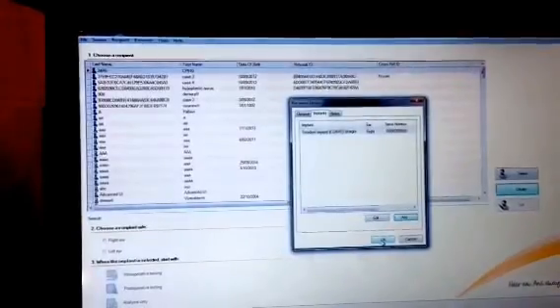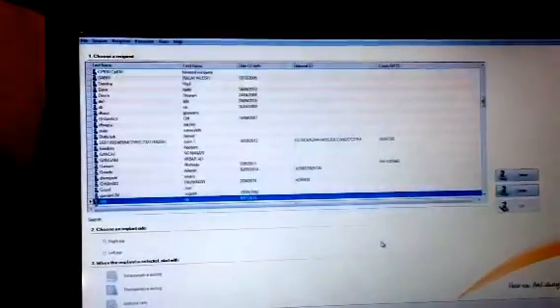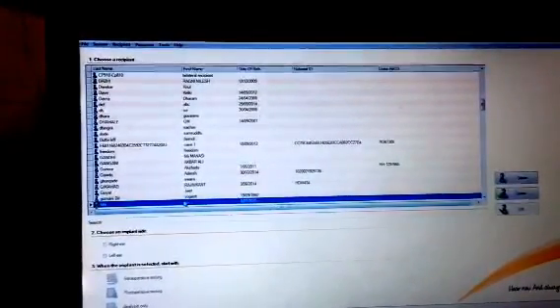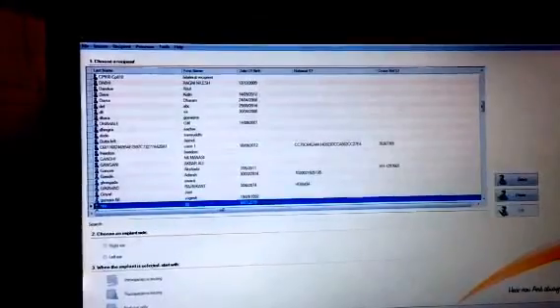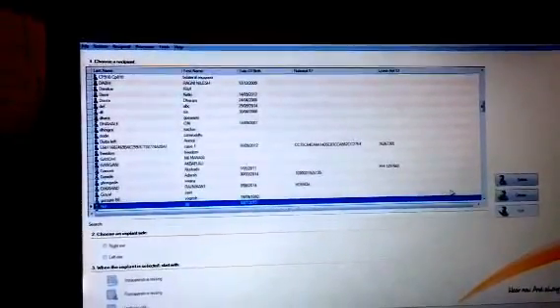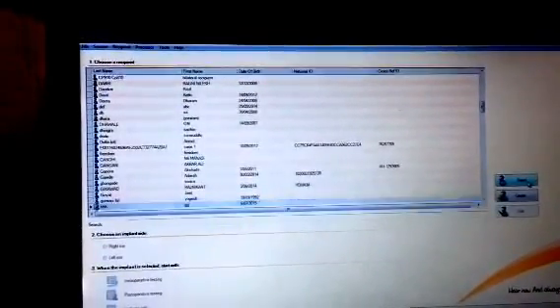Once you have filled in the general information and the implant details, you are ready to do the testing. You will see the name of the patient available in your list. We say select and say intraoperative testing.